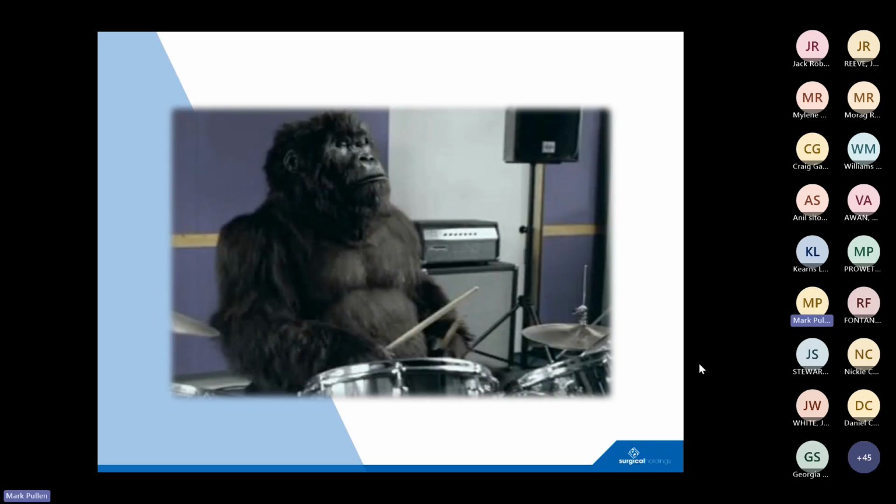Don't know if anyone remembers the famous Cadbury advert with the gorilla drumming. This is something that I saw at a decontamination unit. It was a young lad who had two scopes in his hand, and he was air drumming and then proceeded to move on to his workstation. No prizes for guessing how that ended, but obviously fragile glass on a metal table ended how you would think it did.